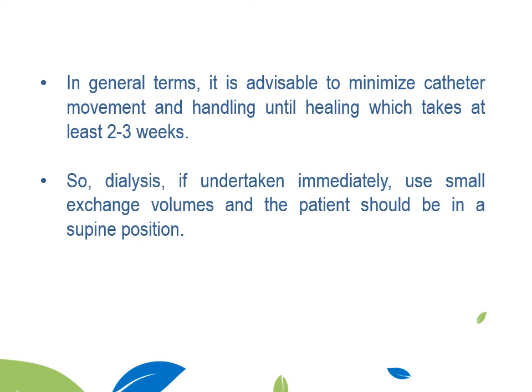One question may arise: what if I need to do urgent dialysis for him? I have to take it immediately. Okay, if you have to undertake dialysis immediately, you can still use this catheter before the 2 to 3 weeks we mentioned earlier, through using small exchange volumes with frequent cycles while the patient is in the supine position. The patient should be in the supine position so that it will minimize the intra-abdominal pressure and will decrease the incidence of leak.